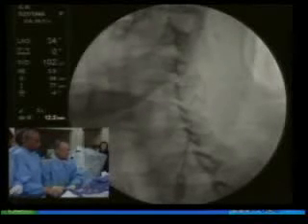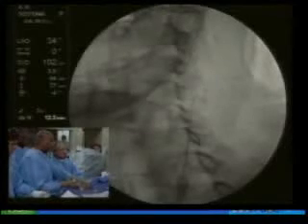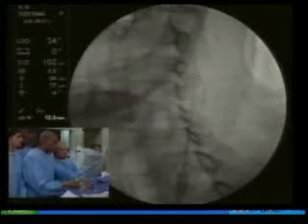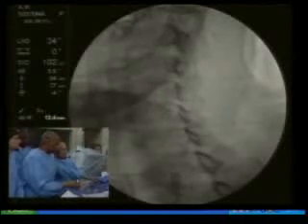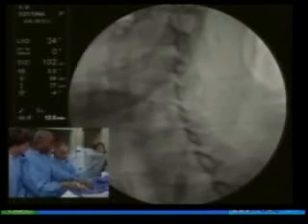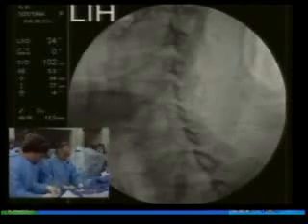So the data is crystal clear that any ischemic event is a harbinger of stroke, and the highest risk is in the first 2 weeks. So with either procedure, our goal should be to get the carotid fixed as fast as possible. With stenting, the reason that the results are not as good is because if you've ever seen a plaque at surgery a week after.